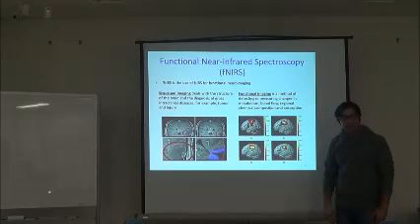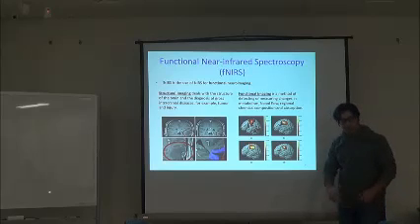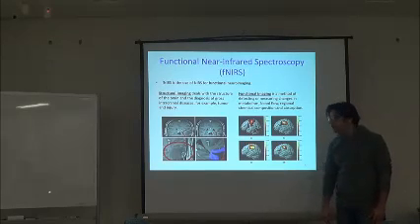We can use the t-value to estimate activities of the brain, but we can also use methods to estimate activity in real time. That's right. In case of real time, we can use the matrix and apply some algorithm.